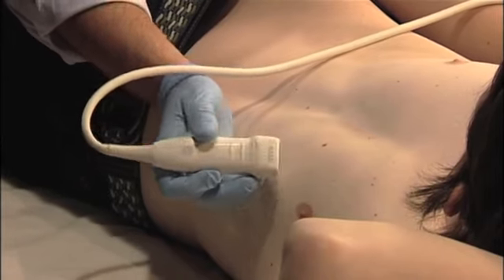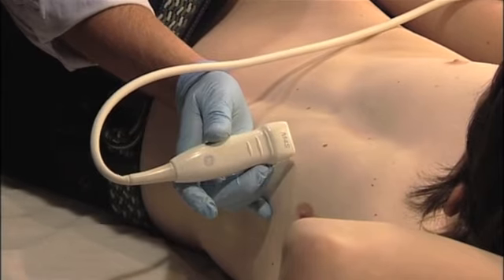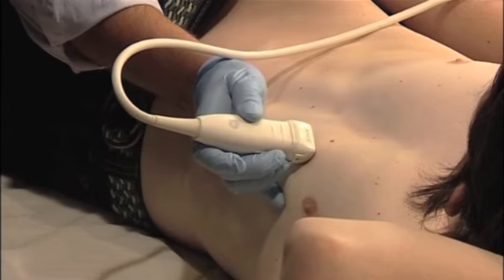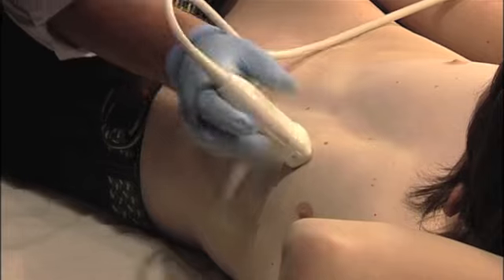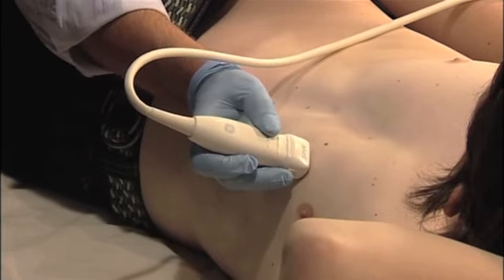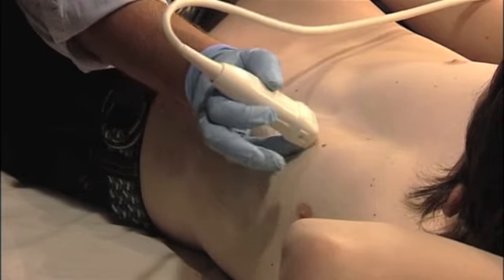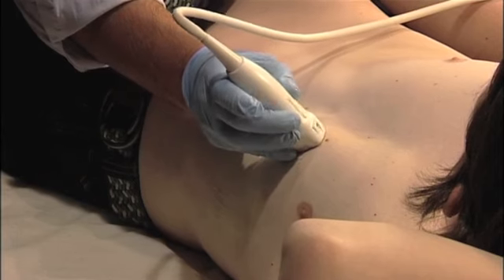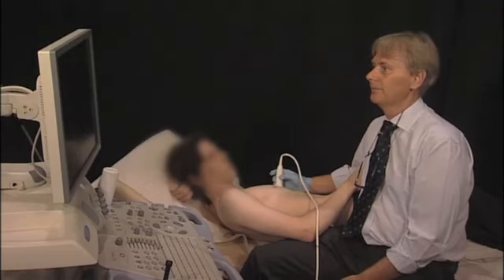The next thing which is very important is to try to have body contact. So I try to leave my whole entire hand on the body, and thereby I have much more stability versus holding the transducer like this. And the other thing which is very important is that when you rotate, at least that's what I would do, I have my little finger, and my little finger kind of gives me an anchor here. You see, this is the anchor, and when I rotate the transducer, I always know where I am, and I don't lose the position during rotation.